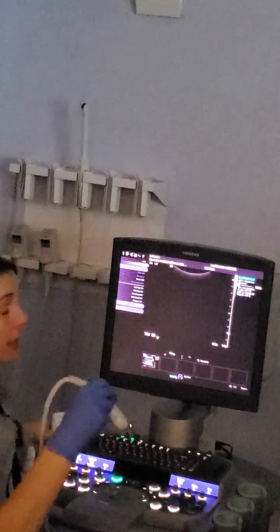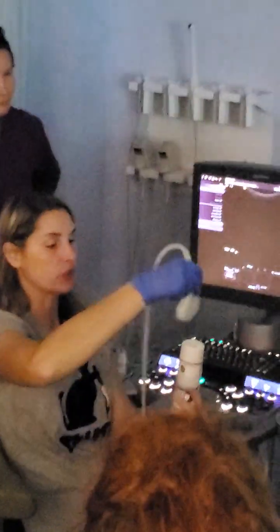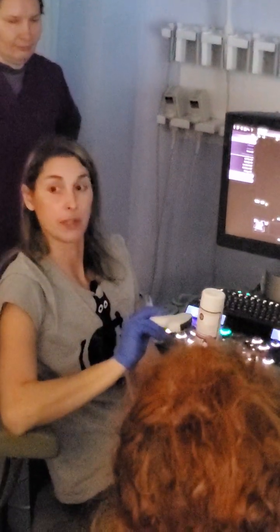The other one that's a real pain is when you have a gallbladder that's pointed straight up. So I see a gallbladder that's pointed straight up. Sag, transverse. Hey, wait, it's still pointed straight up. So in that case, you actually have to change your scan plane by 90 degrees to get your transverse. So it's not just a matter of going from sag to transverse. You actually have to change your entire scan plane to get that transverse.